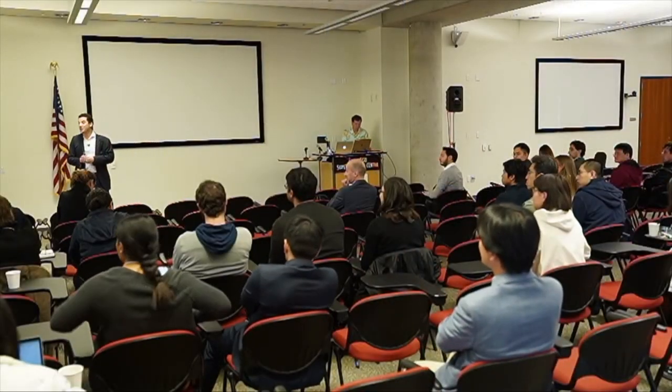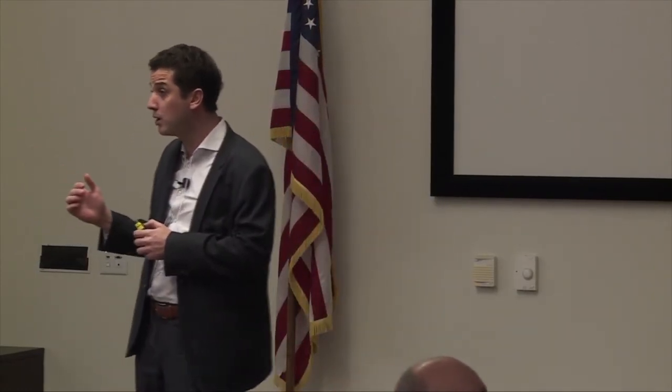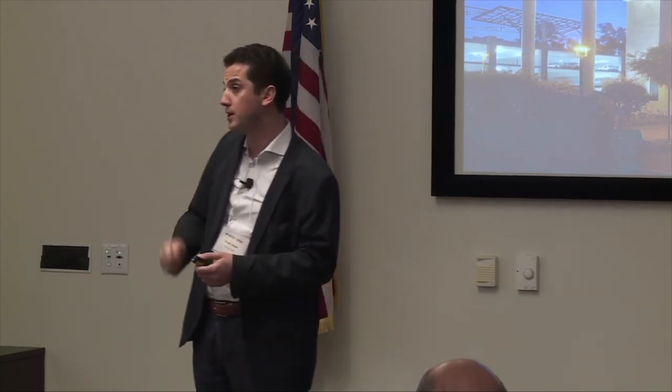This is a golden question if we're able to answer it. And we're trying to do that both in animals and in humans. In animals, what we're trying to do is work with colleagues who do two-photon imaging, like Anna DeVore, in which we can look at the calcium signal during the activity and correlate this calcium signal with the electrophysiology that we record from the surface of the brain to know exactly where is the source of these signals. In humans, when there is tumor resection, we're looking at stimulation subcortically and recording cortically to be able to map the eruption of activity due to stimulation.